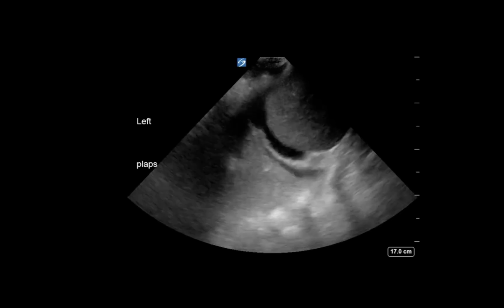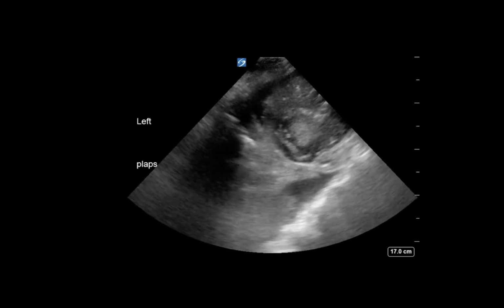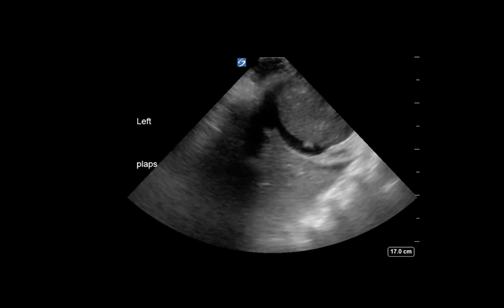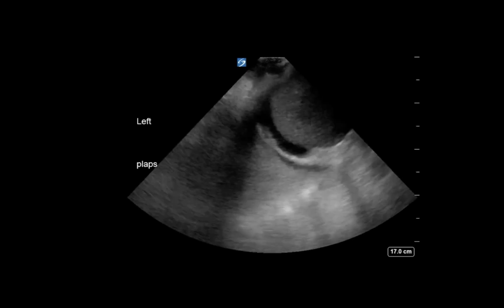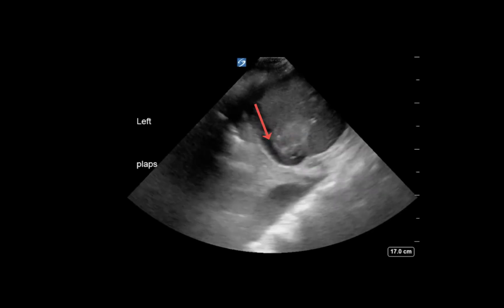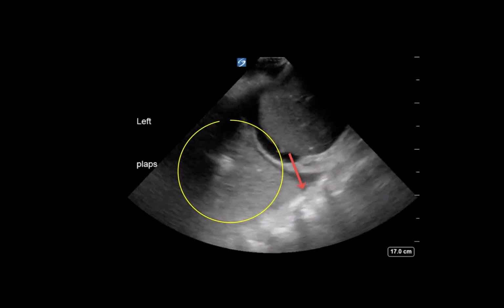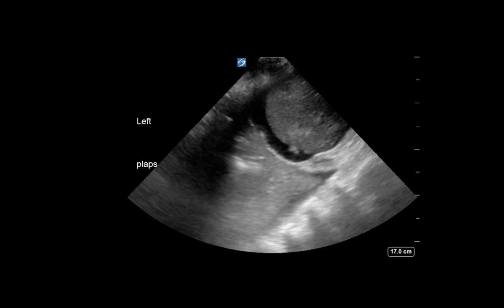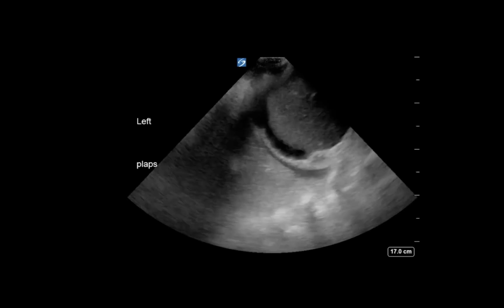This is a great clip to illustrate the integration of everything we've talked about. This clip was taken on the left, and you can see the spleen with what seems to be a lesion or tumor on it. This is a prime example of a left hemithorax, which shows a variety of collections of free fluid. Importantly, there's quite a bit of fluid below the diaphragm, less fluid above the diaphragm. There is a large volume of collapse. In this case, I'm much less likely to call this collapse secondary to effusion. It may in fact be secondary to rising of the hemidiaphragm.